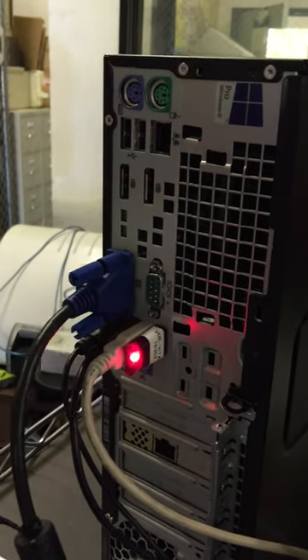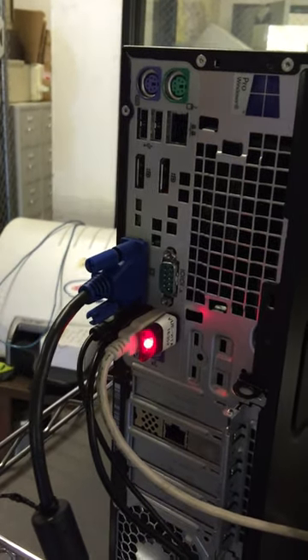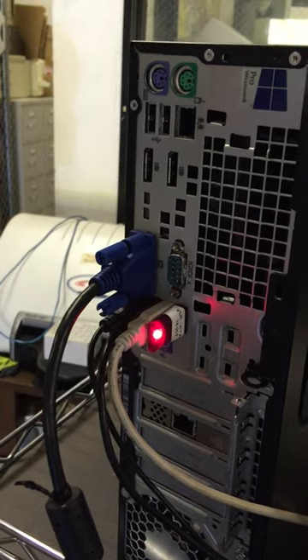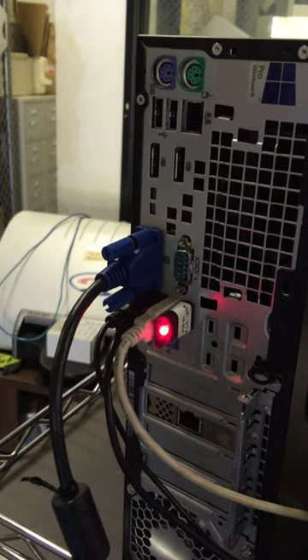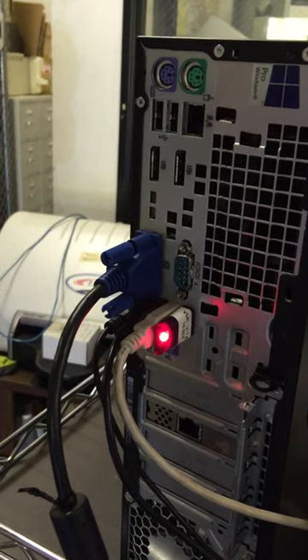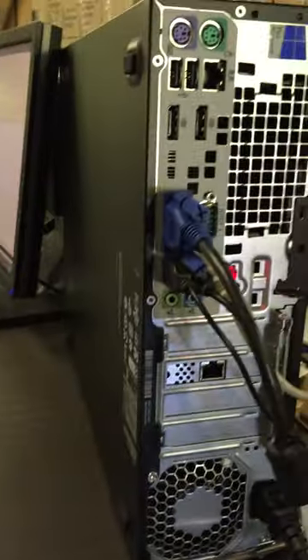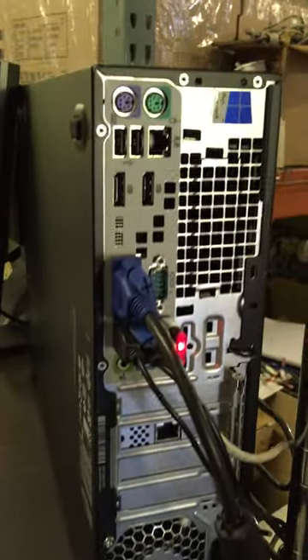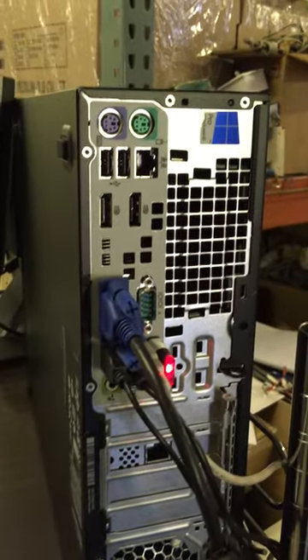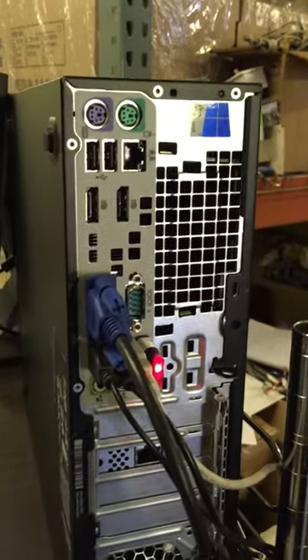And then the next white cord is USB to the scanner, and then the two black cords here are the mouse and the keyboard, and the blue cord is to the monitor.